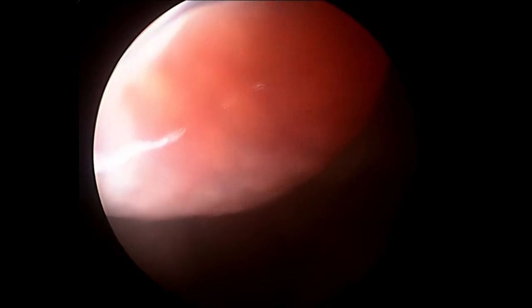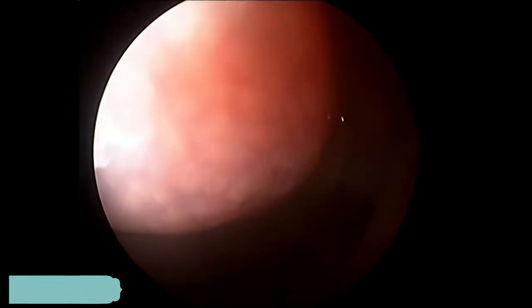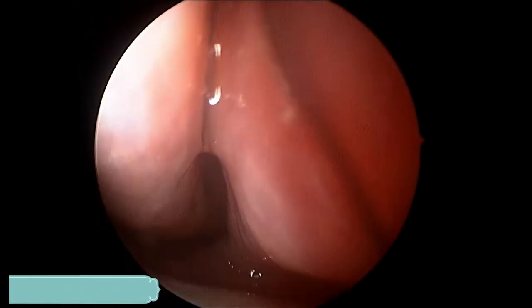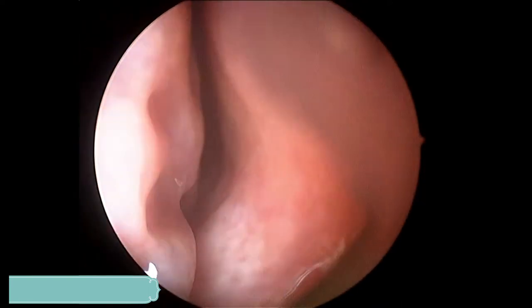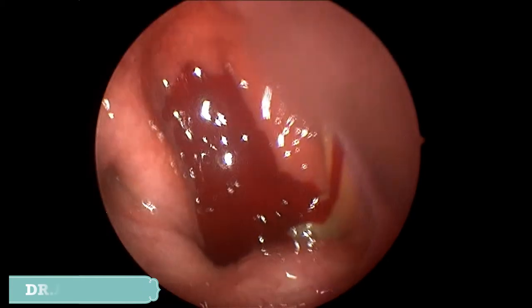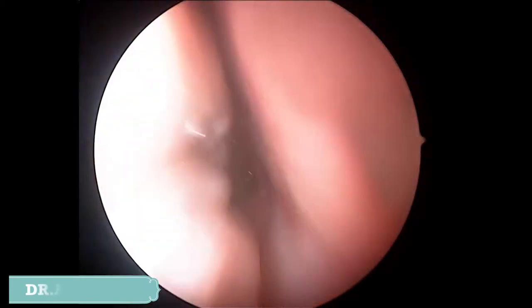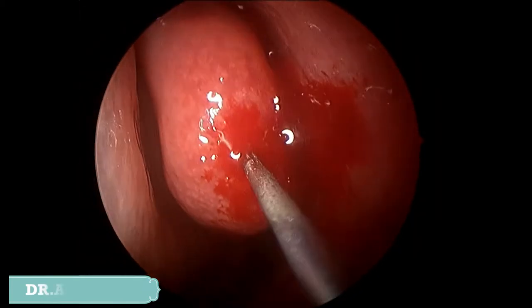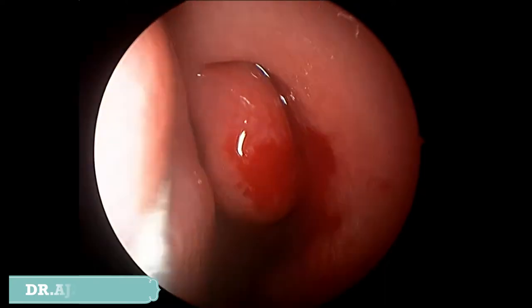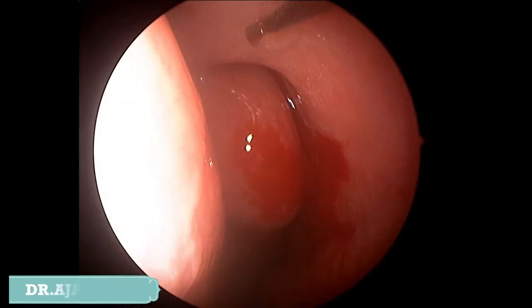This is the endoscopic picture. All the middle turbinate and inferior turbinate were normal, but we could see some inflammatory contents along the middle meatus area extending up to the choana. The other side of the nose was perfectly normal with no involvement, only some secretions along that side. We found a concha bullosa on our MRI picture.